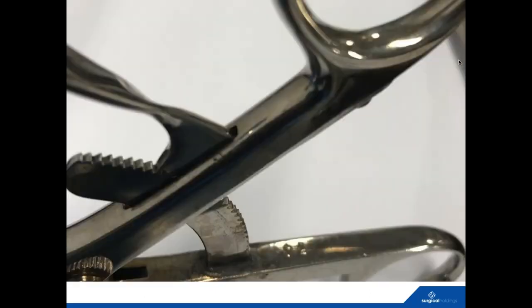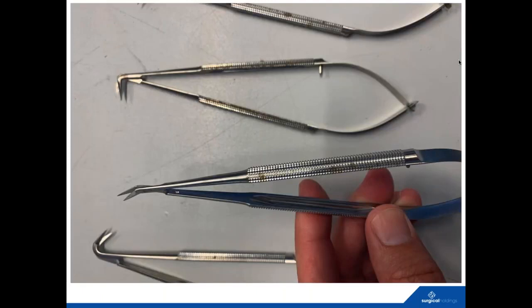Yeah, retractors, check on the racks. You'll see a bit of deterioration there around a weld. That quite often happens on the older ones, which may just be, sorry, not welded. There's either a gap there from the older style ones, or there'll be solder. So that's important to check on those.